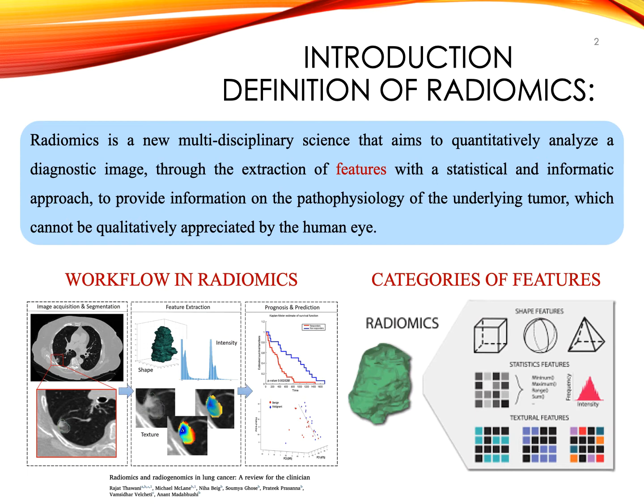The first is the image acquisition. The second is the segmentation of the volume of interest. The third is the feature extraction. The fourth is the selection of the relevant features. And the last one is the setting of a predictive model to classify new inputs.